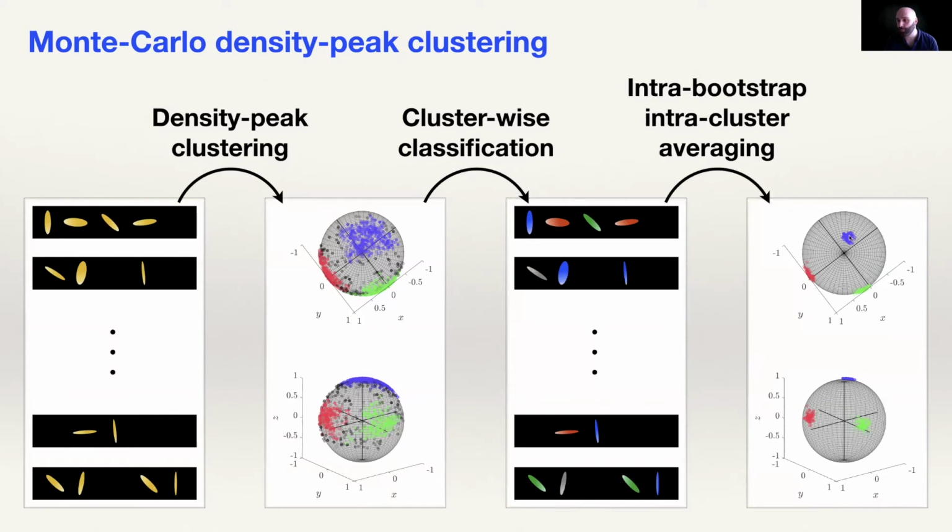So this gives you a pretty good measure of peak orientation, and you can even define a cone that makes sense and that may be different for different fibers. So this is kind of original compared to anything that has been done in tractography, that you can get these cones different for different fibers. Then implementing it in the natural algorithm is a bit harder, but this is different.